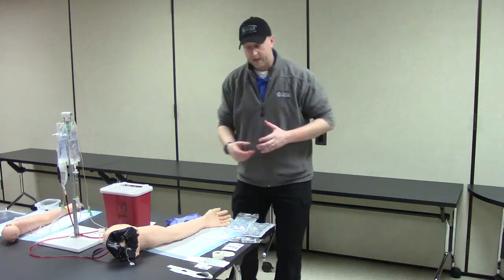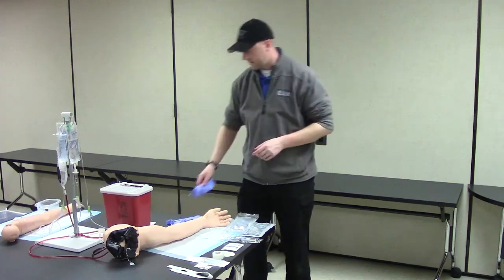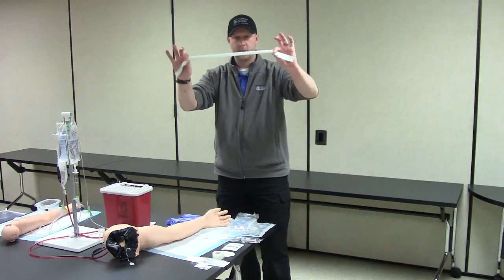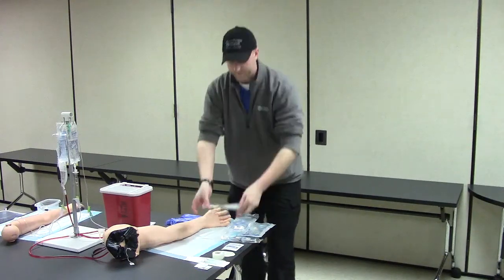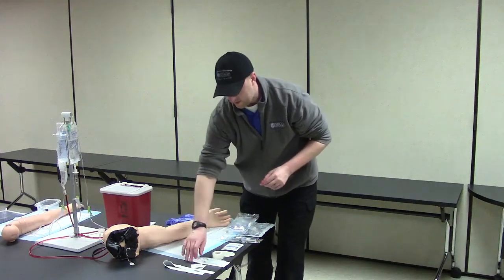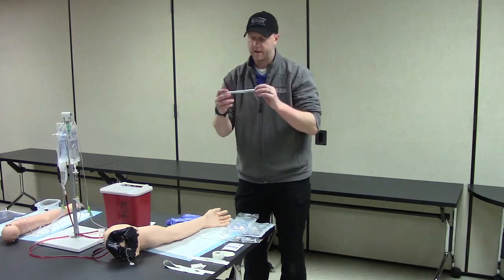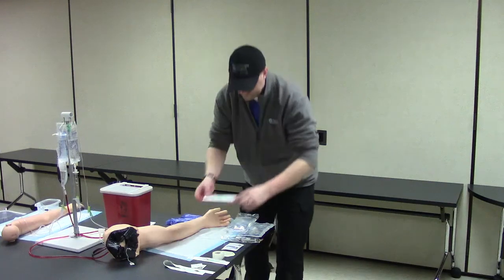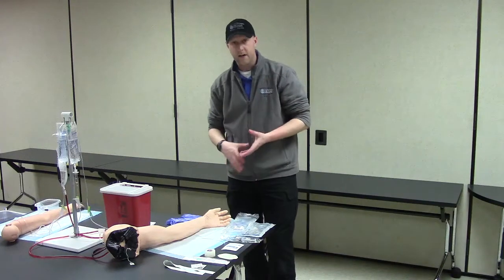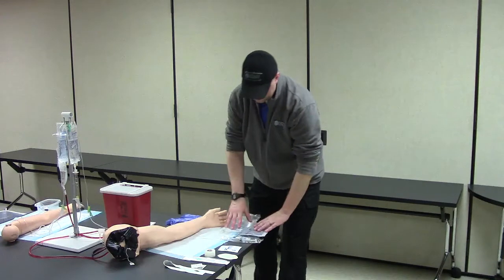As we get started, we need to look at what equipment we need. We're going to be working with blood, so make sure we have our BSI — so we have our gloves. We're going to need to get these veins to engorge, so we have a constricting band or a tourniquet. We have alcohol prep pads to make sure our site is clean and sterile. We have catheters — the size is going to be determined by your patient. Today I'm going to be using an 18-gauge catheter. We have tape to secure our catheter and IV line, and a 2x2 in case we need to wipe up some blood, and then our fluids.